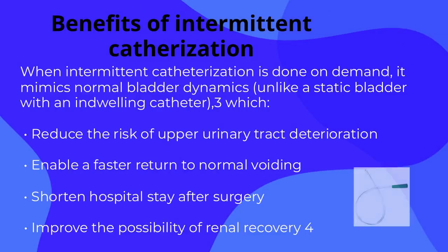Unlike a static bladder with an indwelling catheter, intermittent catheterization is done on demand and mimics normal bladder dynamics, which reduces the risk of upper urinary tract deterioration, enables a faster return to normal voiding, shortens hospital stay after surgery, and improves the possibility of renal recovery.